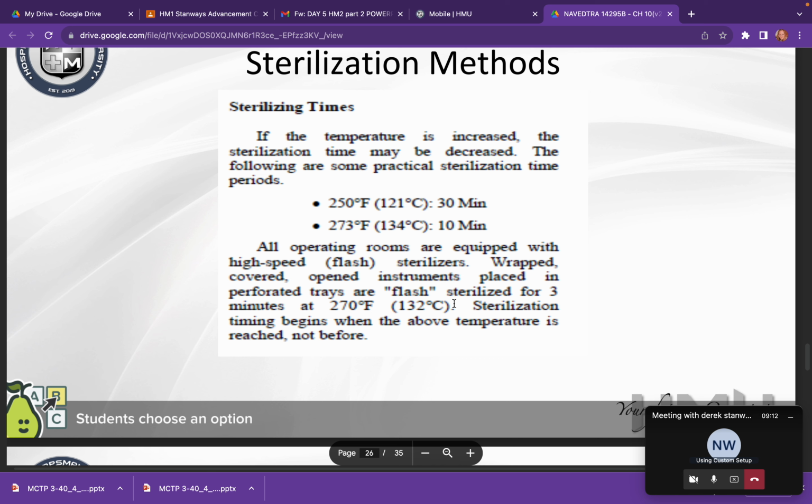So this is an event where they have a case going on, and they have an instrument and they drop it on accident or it becomes compromised. So they have to sterilize it very quickly at a very high temperature at a lesser time. It doesn't have a dry time, and then once they remove it, it's still a little wet, very hot. And it's not something that we use all the time just because it can be compromised. A lot of facilities are going away from using it, actually. But in the Corps manual, it's used from way back when because that used to be almost standard practice because they didn't have this type of instruments. No longer.